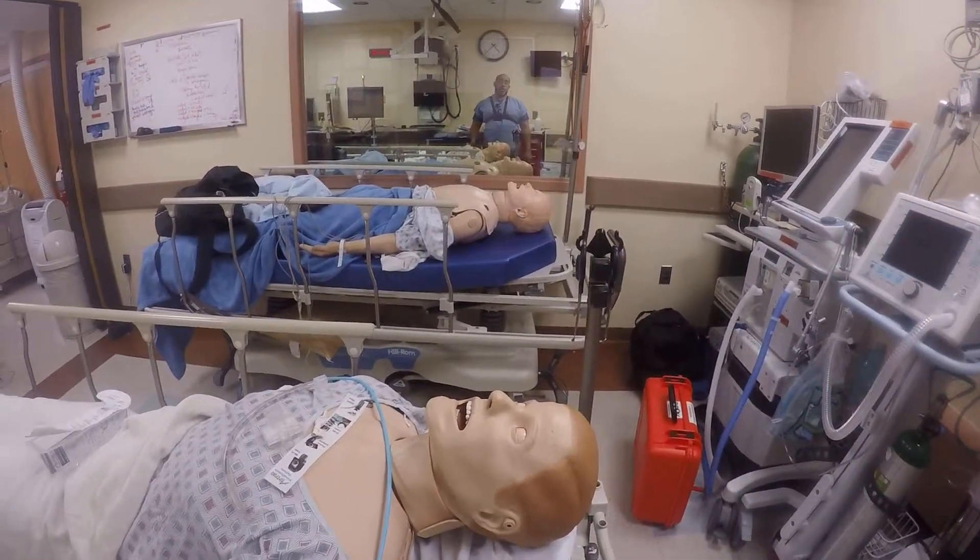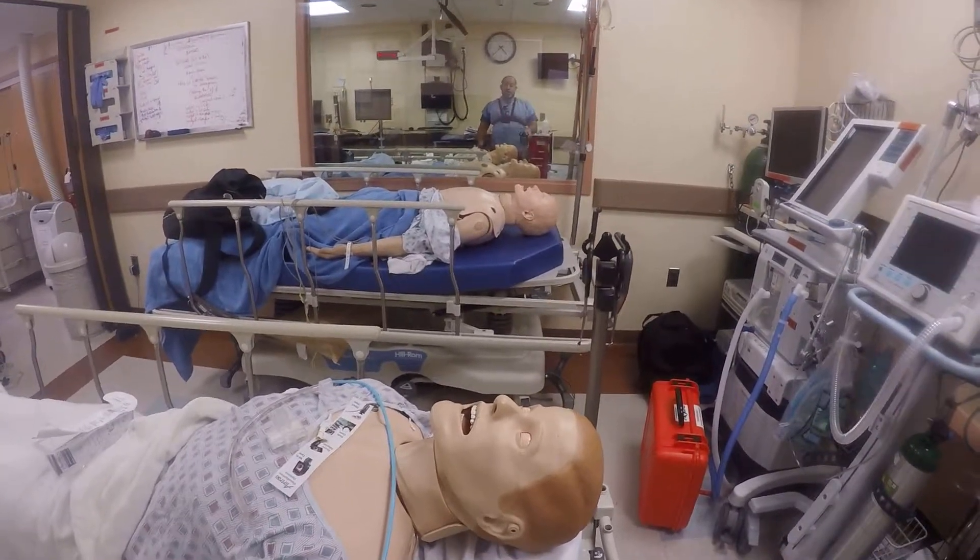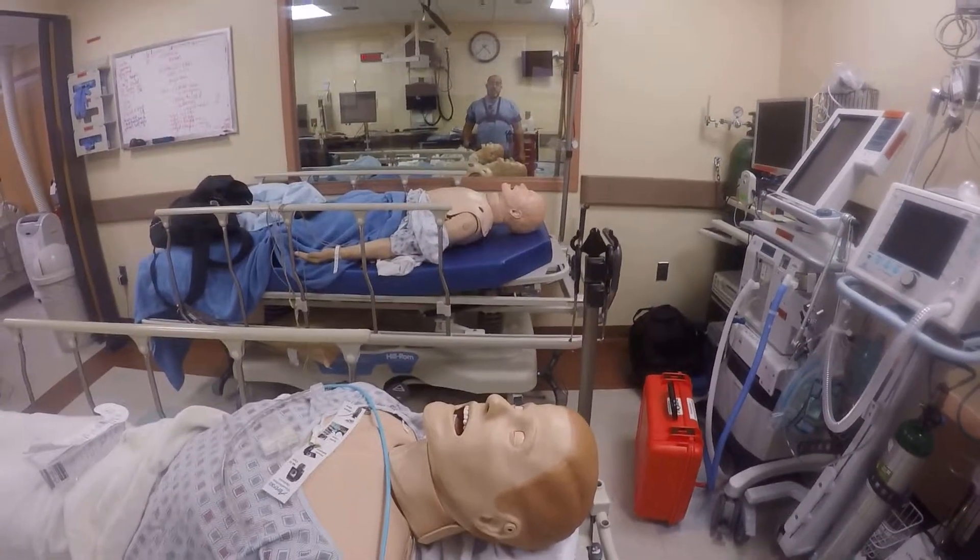Welcome back to an episode of School Airway. I want to teach you one MacGyver maneuver where the bougie becomes your friend.